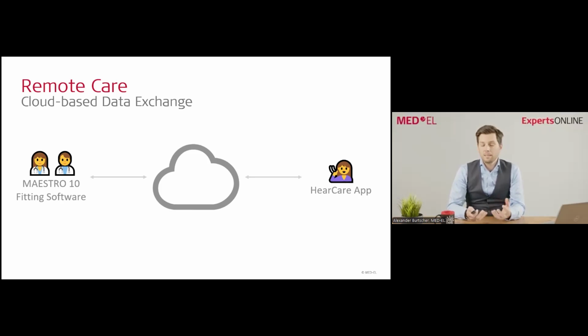So it doesn't need to be at the time when the patient does all these tasks, when the patient is online. So this can be done by the end of the day, for example, if there is a few minutes left, or if there is a dedicated admin time for remote scheduled, for example. It could also be the next day if it's not a pressing issue. And vice versa, the clinician can perform certain tasks in Maestro, i.e. a fitting, setting up a configuration for an audio processor, and then send it also to the cloud, from where the recipient can then download such a configuration and install it on their audio processor by themselves.